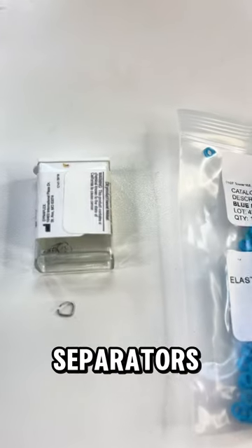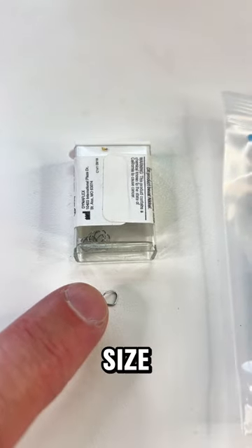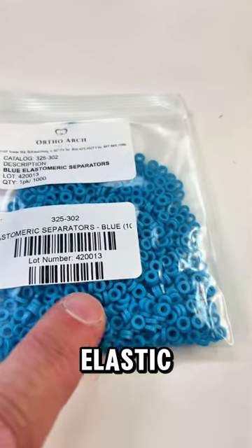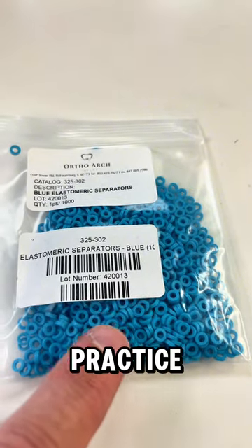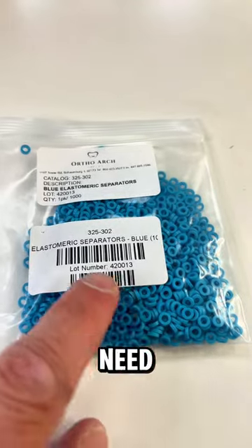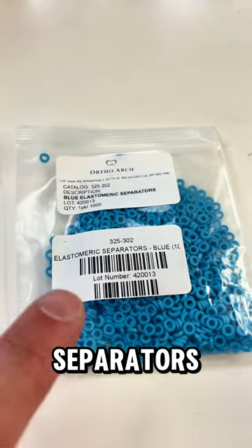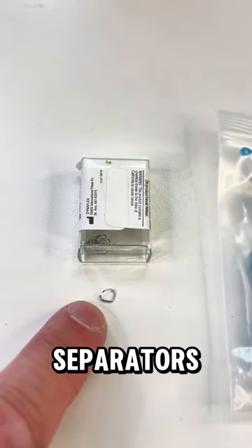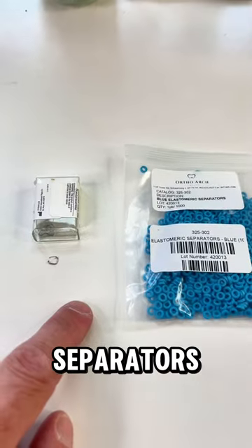You're going to need some separators. I really like these neat spring separators — they come in two sizes: a premolar size and a molar size, so you're going to need both. You can also get elastic separators. I tend not to use these because they tend to fall out, but you'll practice placing them. You just need a few; you could split them between students since you're not going to use all of them, especially for the practice part.